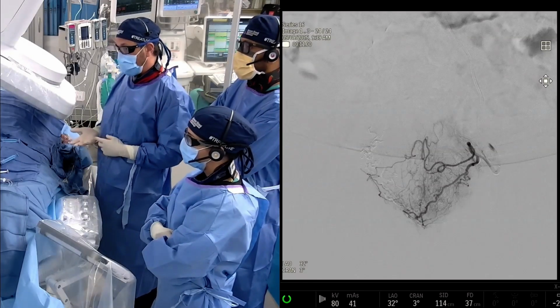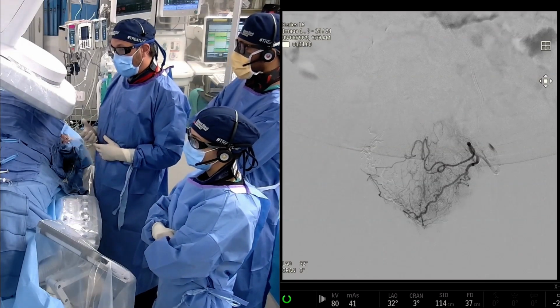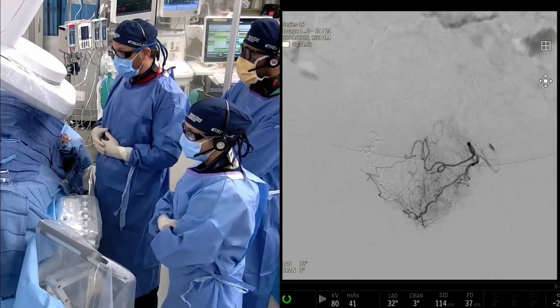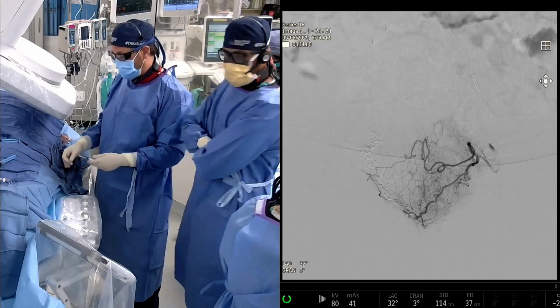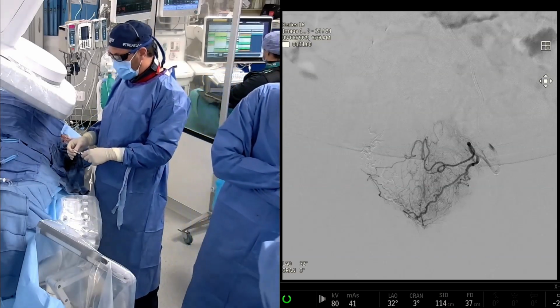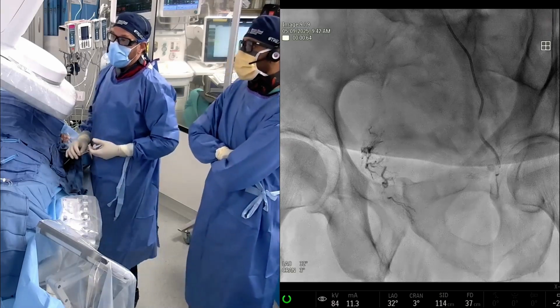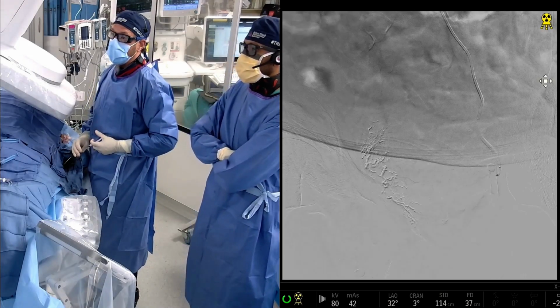Now I could save it and try to do it with one, which we can talk about, because I want to put the balloon up, but I also want to see the difference between the balloon up and the balloon down. I assume it's going to help us, but sometimes when you put the balloon up, it actually redirects blood flow into a place that you don't necessarily want it. So I think we'll just do a run with the balloon down first to start, and then we'll go back and do it with the balloon up in a second.